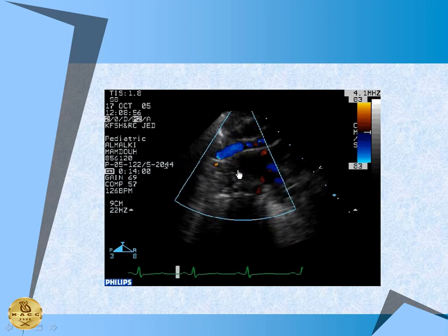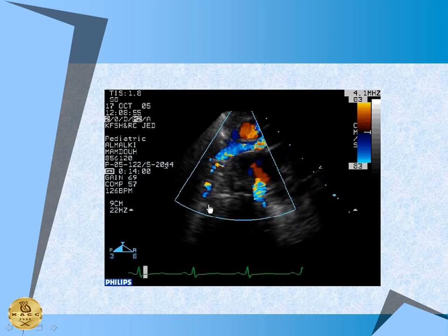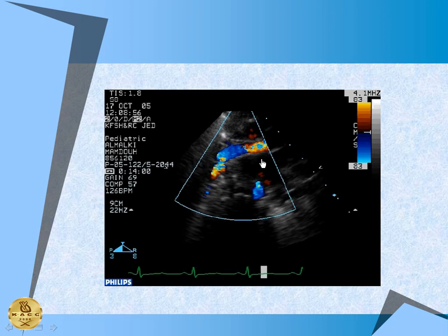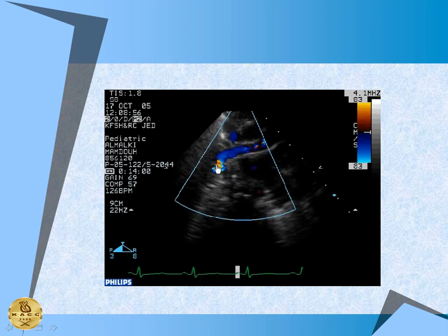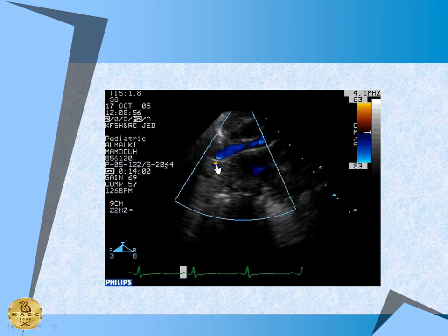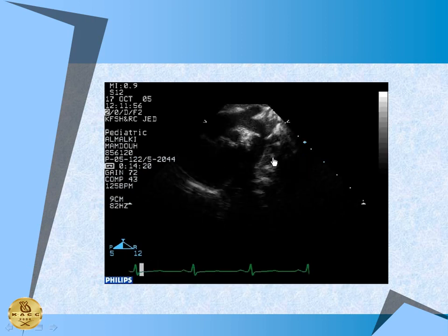Occasionally, in coarctations, especially in syndromic children, we get the lungs also involved. So hypoplastic lesions on the left side can have hypoplastic lesions on the right side. This is a patient with coarctation and distal RPA stenosis. What would be a possible diagnosis? The Noonan, Turner, Williams connection. One of those can give you such a thing.